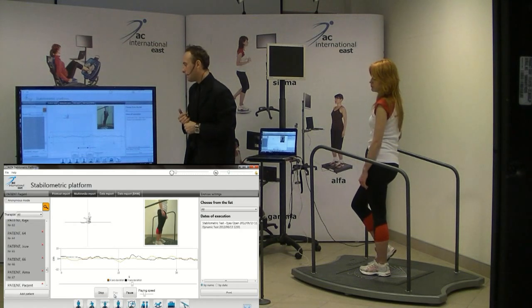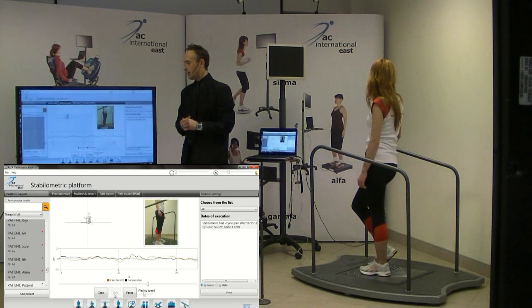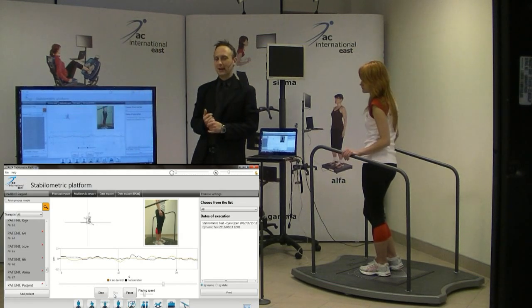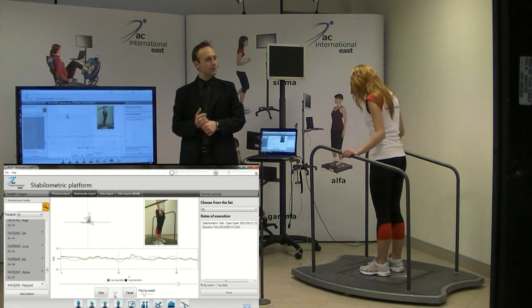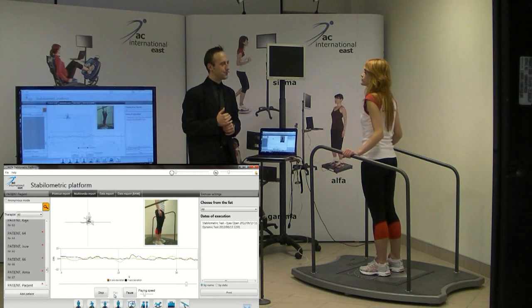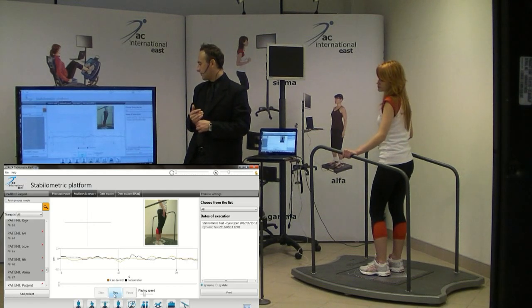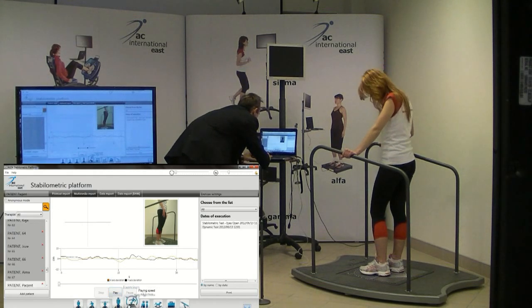the dynamic test. Okay? According to the test, if you imagine the patient has some problem in one path, we can also apply the specific exercises for the patient. So now we will do the exercises according to the dynamic test. Okay? There will be also 2 kinds of exercises that we want to apply for you. Okay, so we go into the exercises.